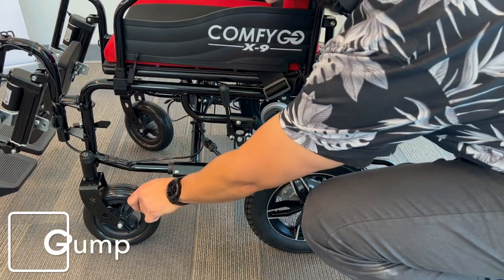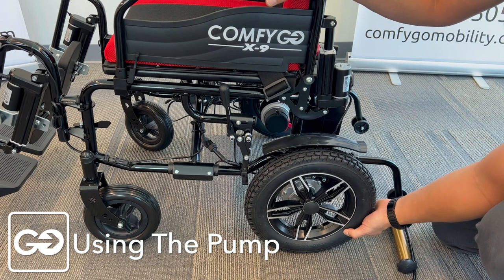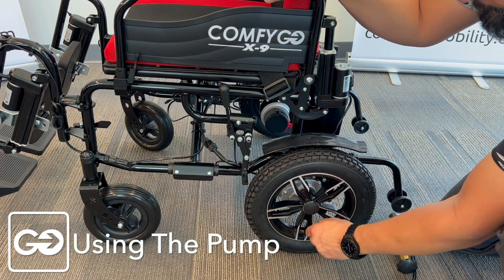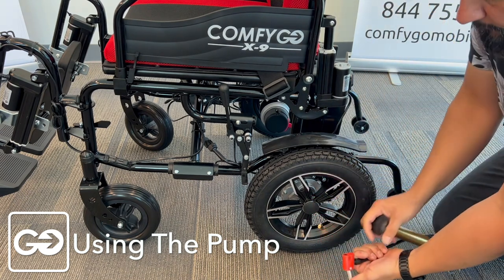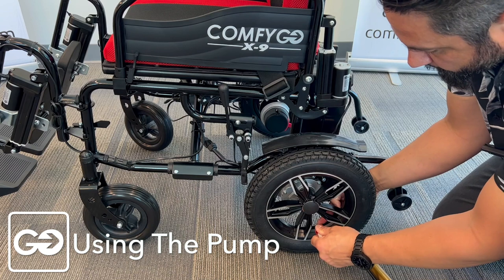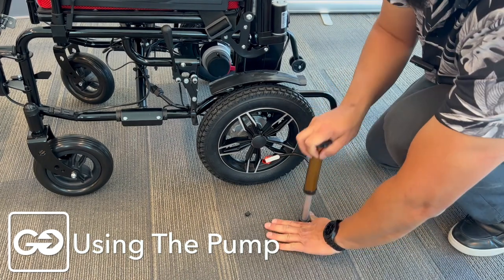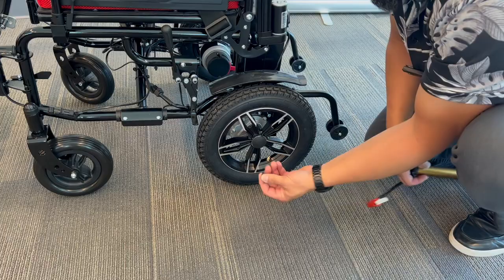On the X9, our front tires are solid tires — they don't need inflating. Our rear tires are pneumatic tires and they do come properly inflated, but we want to make sure they have a little more air. The max pressure you want to put on here is 35 PSI. I'm going to take off our valve stem cap cover and take the pump that was provided in our box. The hole right here on the top matches this valve stem — push it on, you'll hear air coming out, and quickly lock that in place. Then pump to get our tire properly inflated. Pull this tab, pop it off, and reinstall our valve cap.